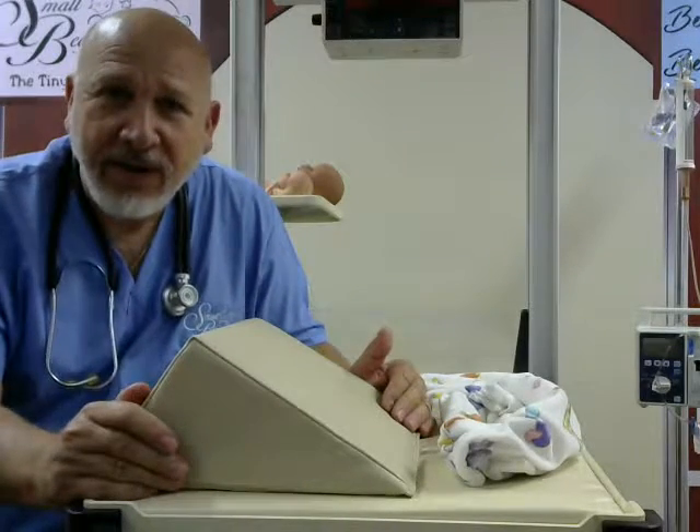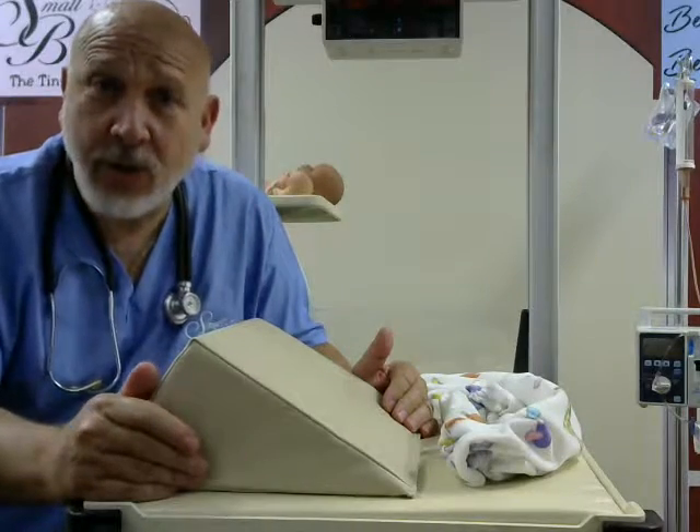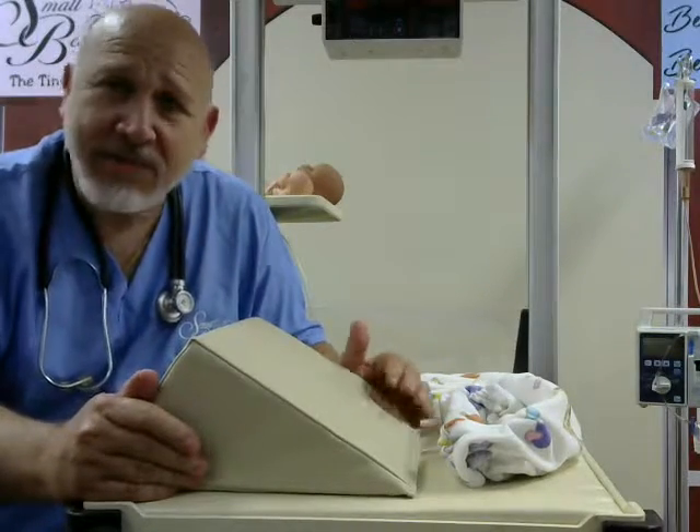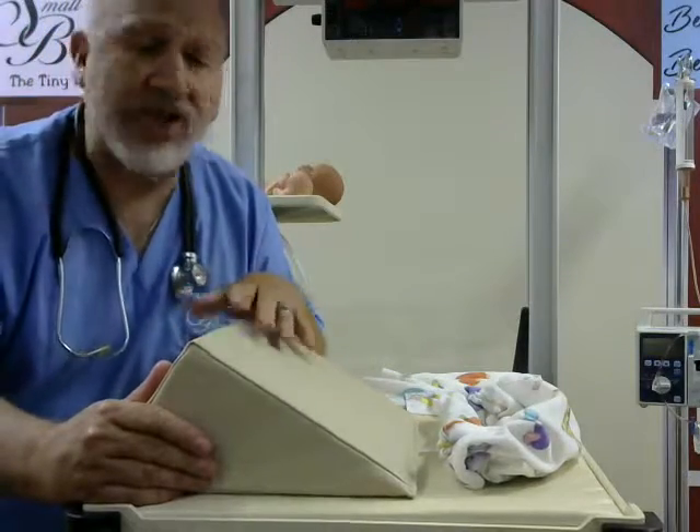Hi, I'm Phil Rigoni, Respiratory Therapist, Physician Assistant, and the COO of Small Beginnings. And I'm here to show you our newest product, which is called the Reflux Wedge and Reflux Harness.